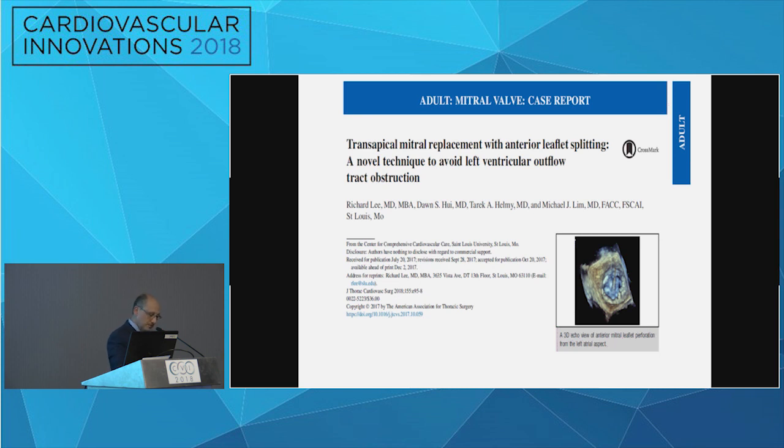And I think of how much perivalvular leak you're going to have because of that, and hypothetically you're slicing the leaflet in a different spot, so you're touching whatever the annulus is there with no leaflet. The idea people have thought about when you put a valve in MAC is creating a rim of leaflets that can potentially decrease your perivalvular leak. So I agree with you, and this is one of the points that we made: you puncture in the middle of the A2, so you actually have a little bit of a rim.